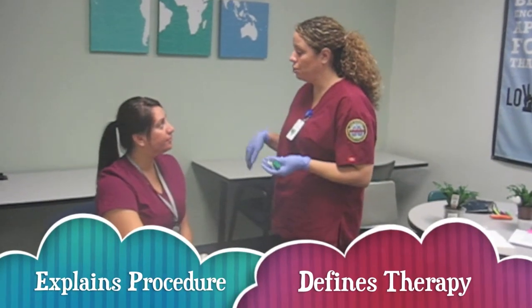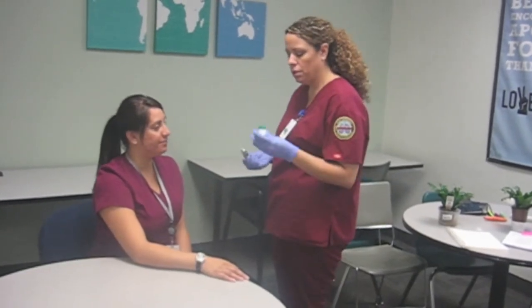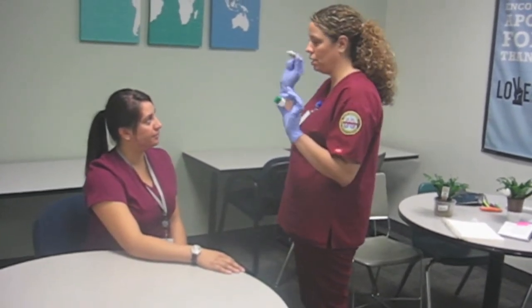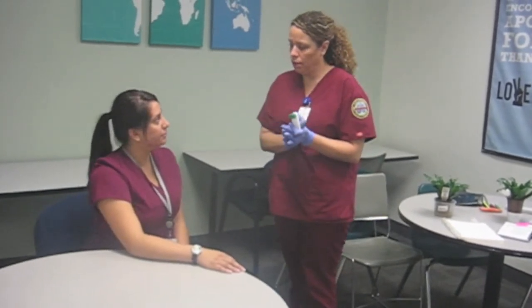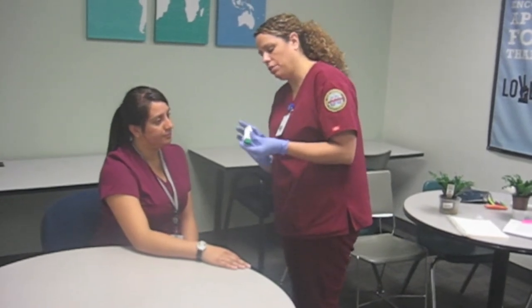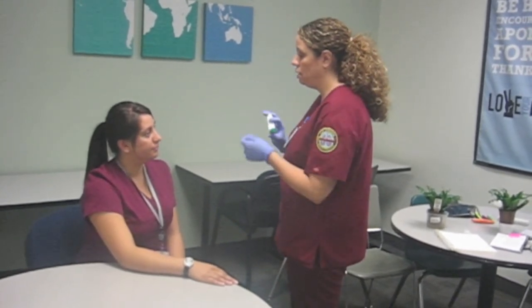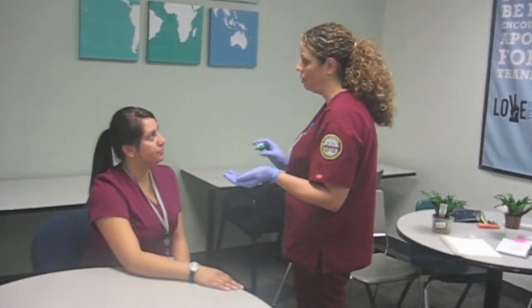I'm going to explain that the doctor has ordered an inhaler for you, and I'm going to teach you how to use it. So this is an actuator — it's the pump that holds the canister. First, we want to start by warming the canister up. Then we're going to insert the canister — it just clips right in — and then we want to shake it. The purpose of shaking it is to make sure all the medication gets dispersed evenly so that you get the best dose possible.